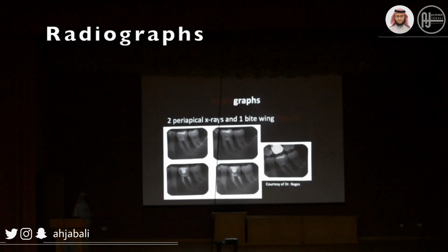Radiographs are important, and by recommendation of the American Association of Endodontists, you have to take at least 2 periapical X-rays and 1 bitewing.